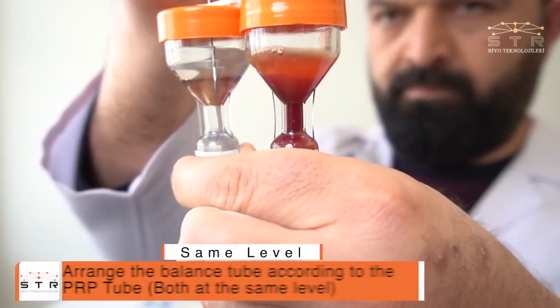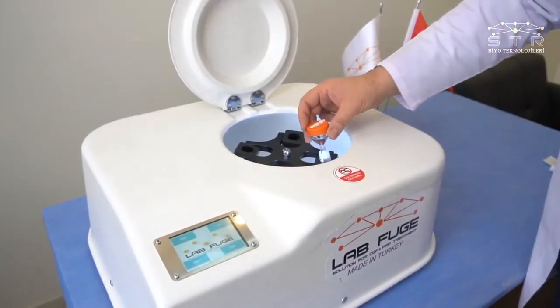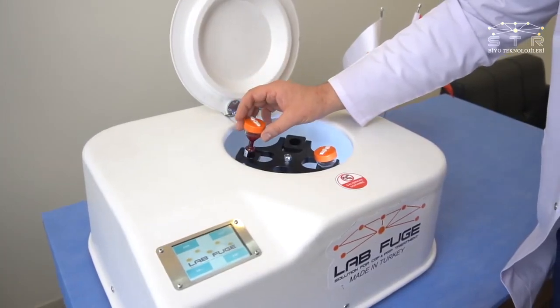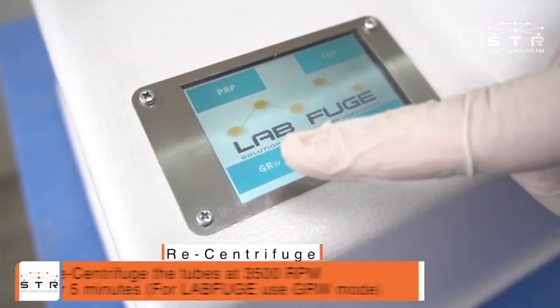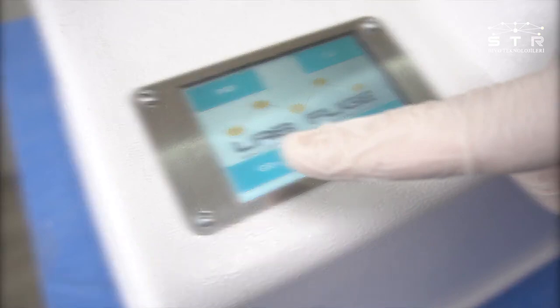Arrange the balance tube according to the PRP tube, both at the same level. Recentrifuge the tubes at 3500 rpm for 5 minutes. For labfuge, use GRW mode.